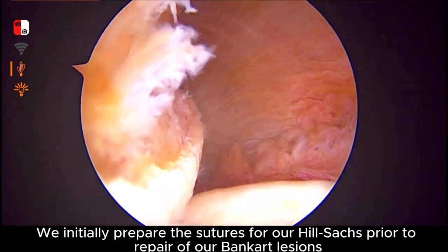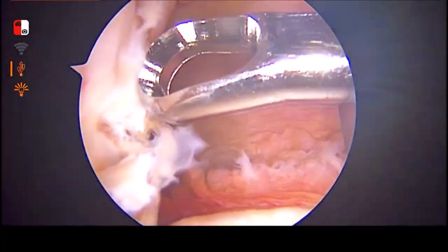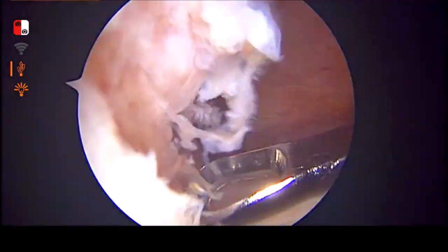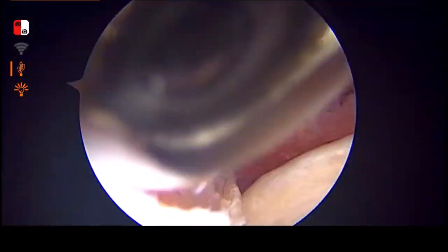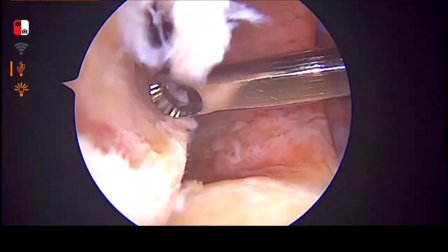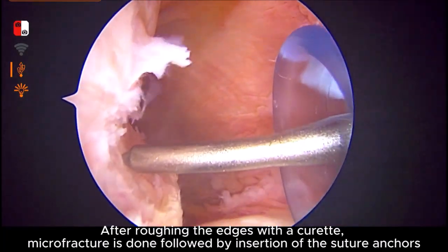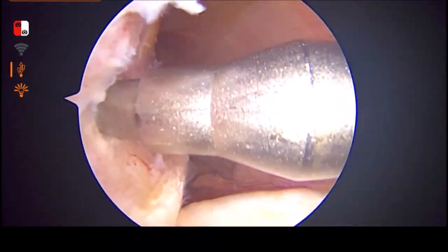We initially prepare the sutures for our Hill-Sachs repair prior to repair of our Bankart lesions. After roughing the edges with a curette, microfracture is done followed by insertion of the suture anchors.